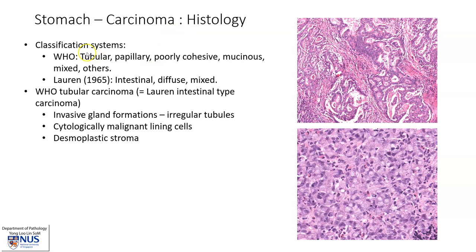On histology, there are several classification systems used for gastric carcinoma. Two of the best known are the WHO classification, which includes tubular, papillary, poorly cohesive, mucinous, mixed, and other types; and the Lauren 1965 system, which includes intestinal type, diffuse type, and mixed type. In the case we have just seen — poorly cohesive with signet ring morphology — this falls into the WHO poorly cohesive carcinoma and the Lauren diffuse type carcinoma.